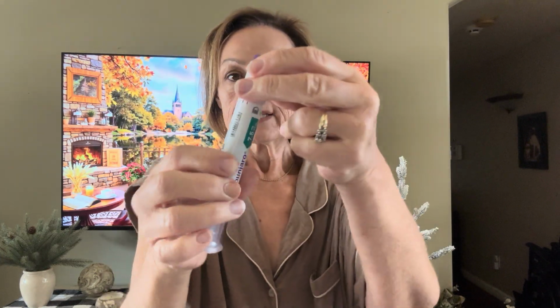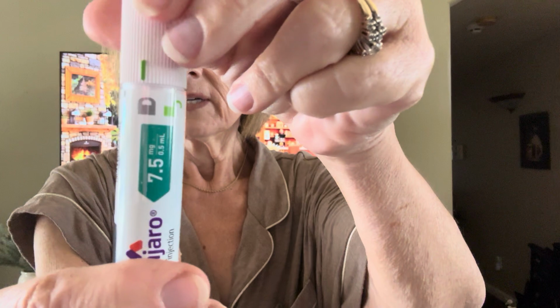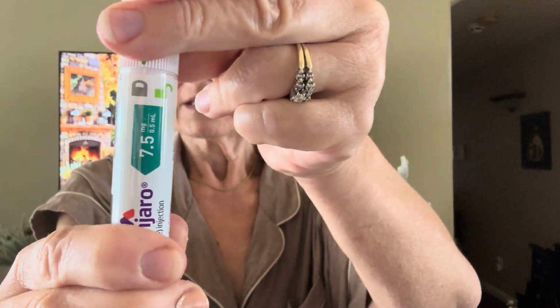We're going to take off the plunger, and you guys know once you get going, it does not take a lot of time to do all this. So we're going to go to the unlock position. Wow, this one just feels so much easier. So if you want, rest your arm right here and then get the fatty part, which I think when you're like this, you can either go this way, you can reach around. If you feel more comfortable, you could go like this.